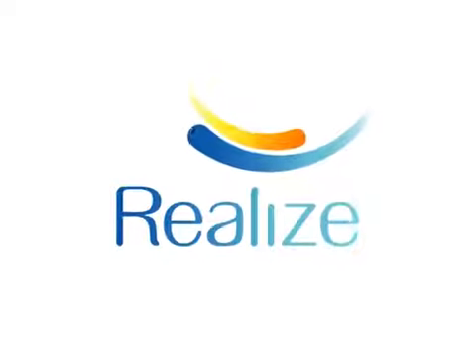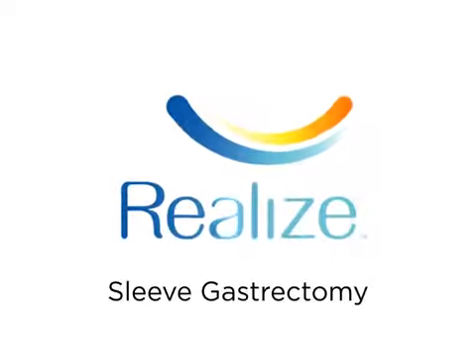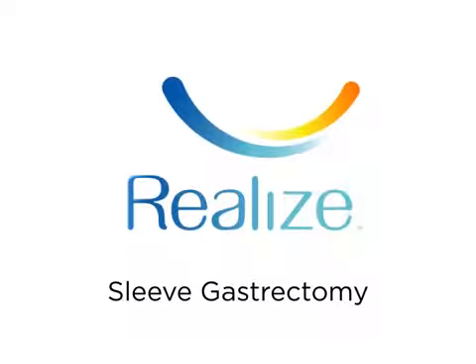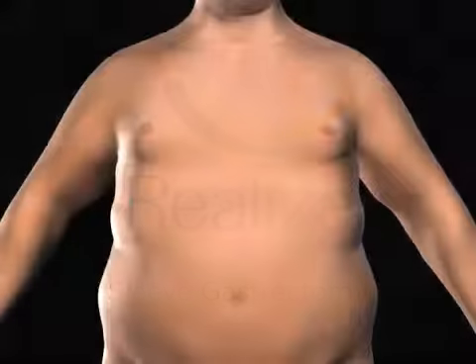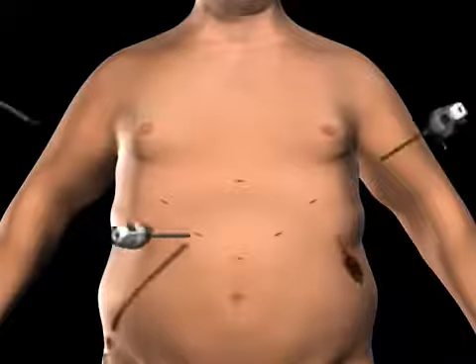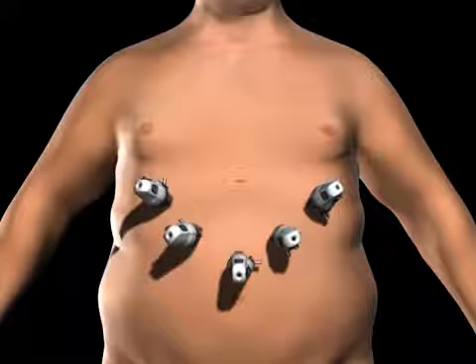The sleeve gastrectomy is a restrictive procedure, which limits the amount of food you can eat by reducing the size of your stomach. To gain access to the abdominal cavity, small incisions are created on the abdomen. Trocars, which serve as passageways for the surgical instruments, are placed into the incisions.